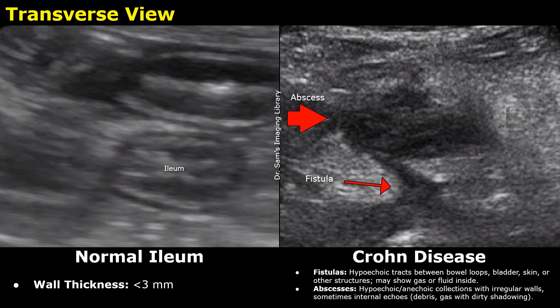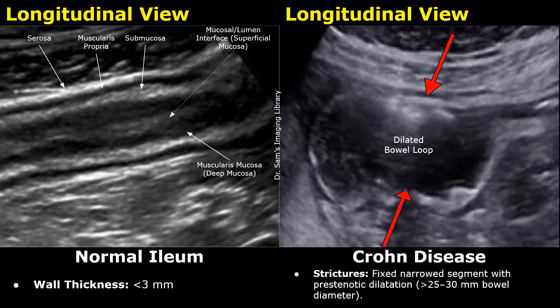In chronic and severe cases of Crohn's disease, fistulas can form. On ultrasound, they may appear as hypoechoic tracts between the bowel loops, bladder, skin, or other structures, though their visualization can be difficult. Abscesses may also occur, typically appearing as hypoechoic or anechoic collections with irregular walls and heterogeneous areas. A stricture may also occur, referring to a dilated bowel segment just before the segment affected by Crohn's disease. The dilated bowel may have a diameter greater than 3 cm, and this is often called prestenotic dilatation.